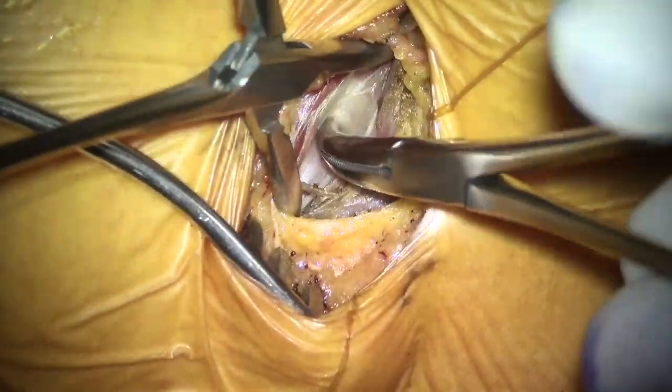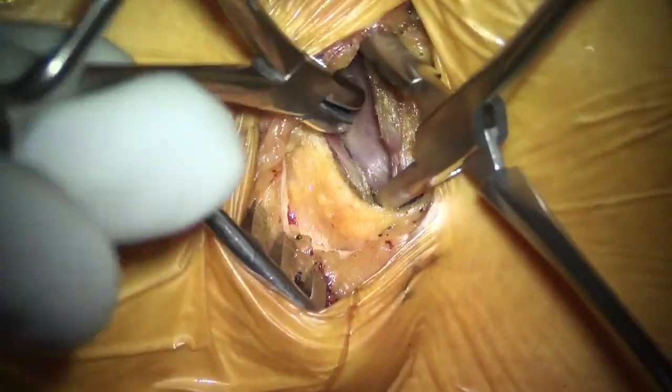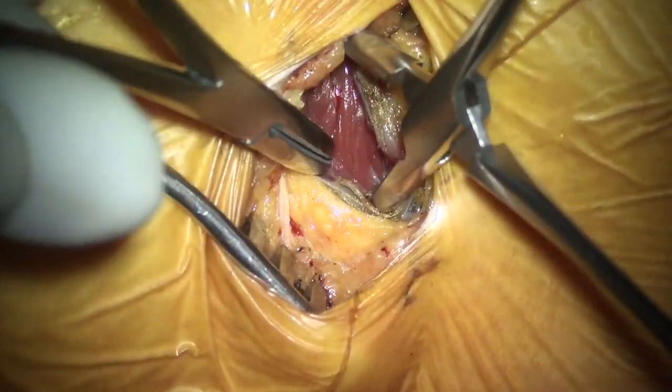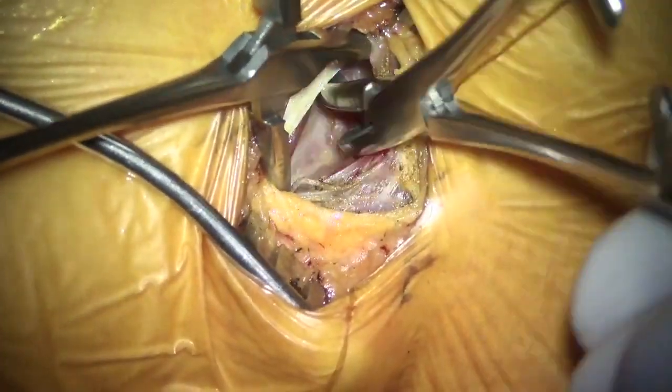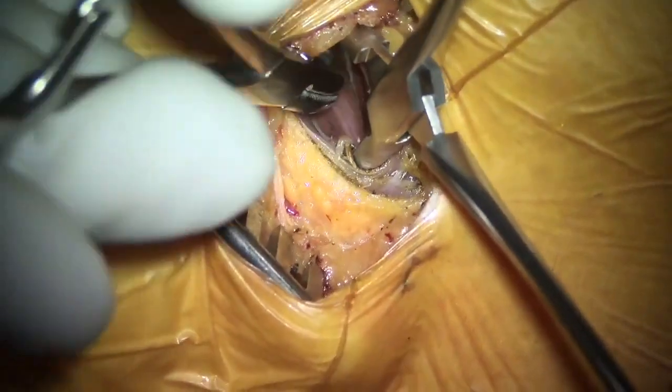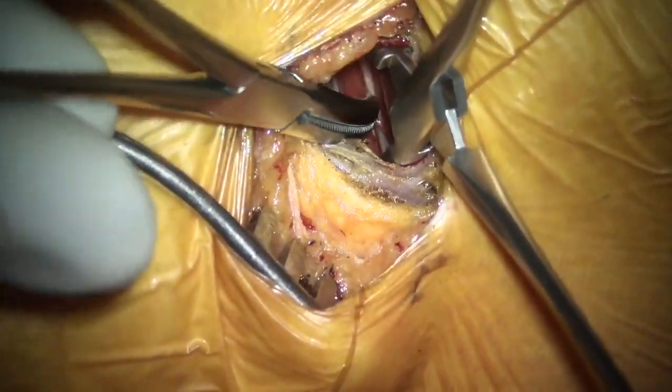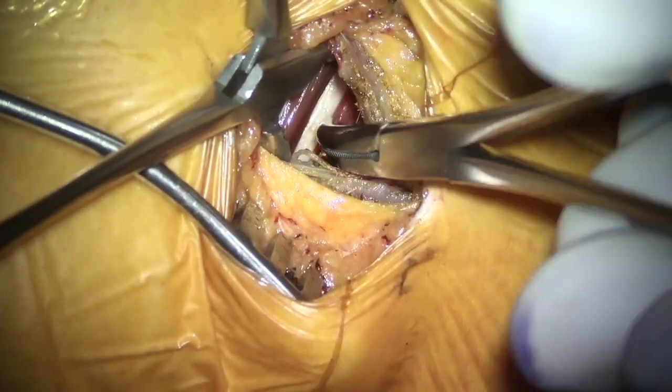Place a small incision on the anterolateral aspect of the abdomen and open up the fascia. Once you open the fascia, you need to do blunt dissection using artery forceps. The muscle you can see is the external oblique, then comes the internal oblique — you can see the different crisscross patterns.